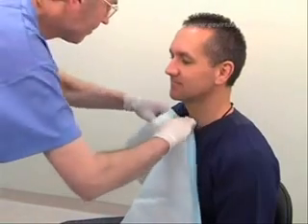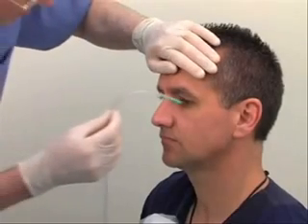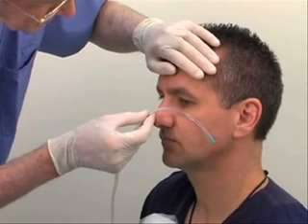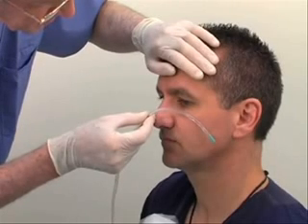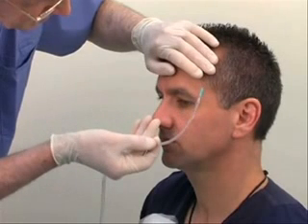Drape a linen protector over the patient's clothing. During insertion, the tube has to point downwards and towards the patient's ear. Once it has reached the nasopharynx, twist it to 180 degrees. This minimizes the risk of the tube coiling at the back of the mouth.